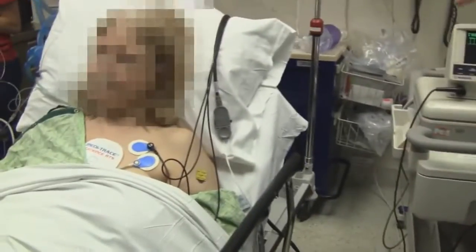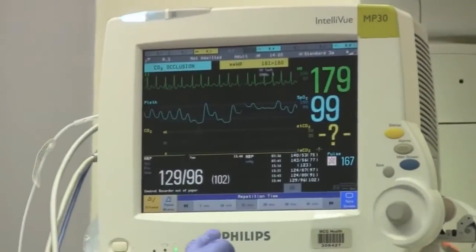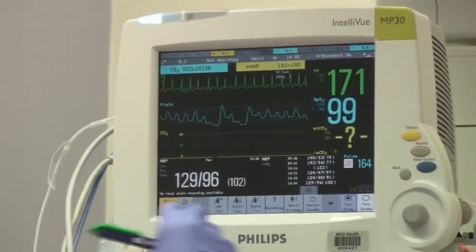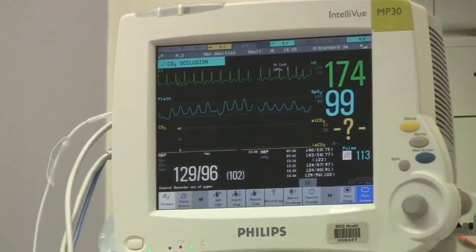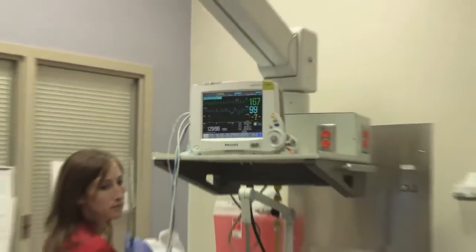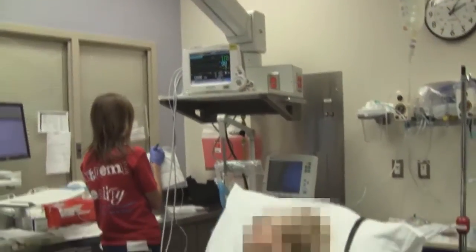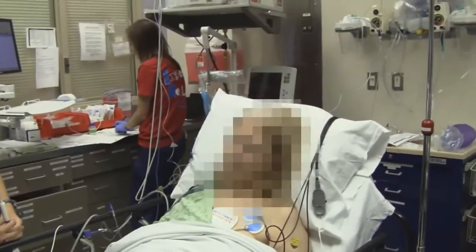We actually have the pads on your chest already. Do you mind being on YouTube? Yeah, I don't mind. What voltages are we going to use? I believe we're going to do 50 joules to start. Our cardiologist is standing here at the bedside, leading and directing this procedure.